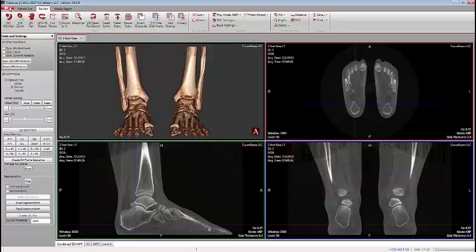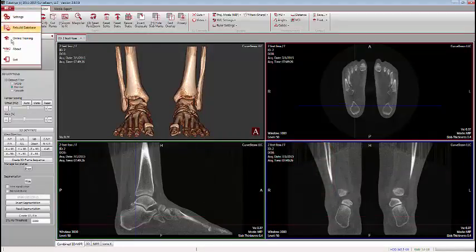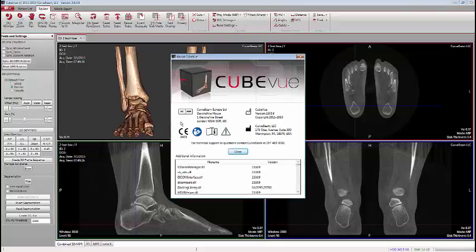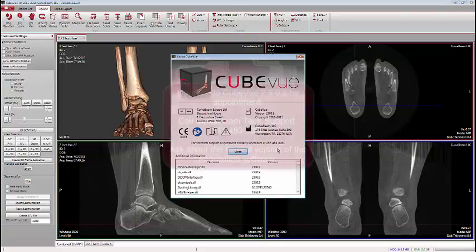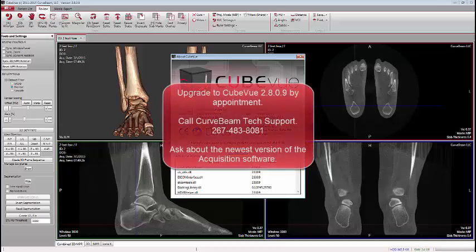In closing, if you'd like to upgrade to CubeView version 2.8.0.9, go to your upper left corner menu, select About, and you'll have the number available to contact CubBeam Technical Support to schedule your upgrade. That is done by appointment only, so be sure to contact CubBeam at 267-483-8081.